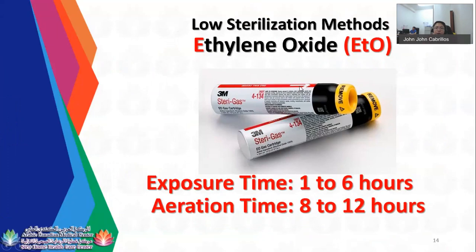So the exposure time of your ethylene oxide is actually 1 to 6 hours. This is your sample of your gas canister or gas cartridge of ethylene oxide. Aeration time is 8 to 12 hours, okay? So aeration means moving air to facilitate removal of toxic residuals after exposure to ETO. Ethylene oxide is a toxic gas. So aeration is moving air to facilitate removal from the chamber of toxic residuals after exposure. Once it is exposed to ETO, aeration is done at the last part. It will facilitate removal of toxic residuals. So the gas concentration of ethylene oxide is 450 milligrams per liter to 1,200 milligrams per liter.